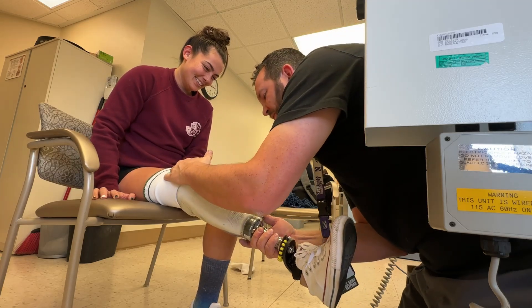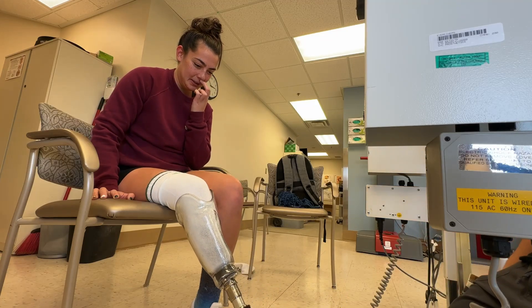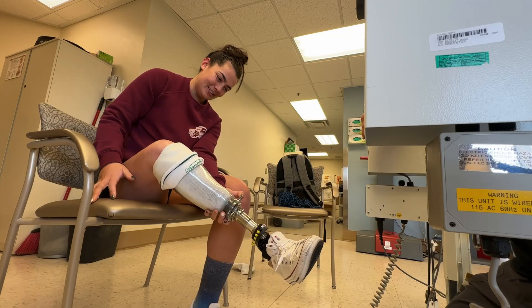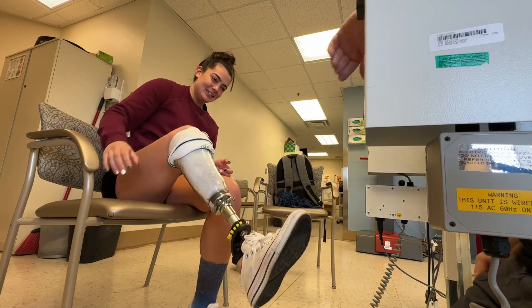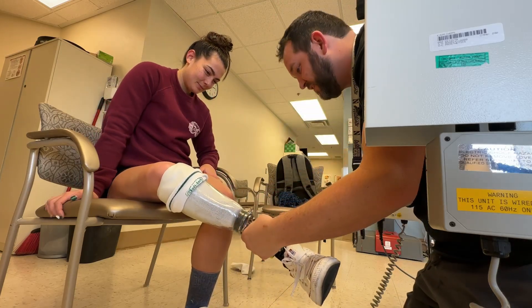We've got the binding, so we've got to push down to get it to release. Do you want me to take off the liner? Can you? Maybe. If you can, that would be amazing. No, I think we're too far in. All right. Because I've got another way of doing this. It's because it put a turn on the pin? You're all right for sure?